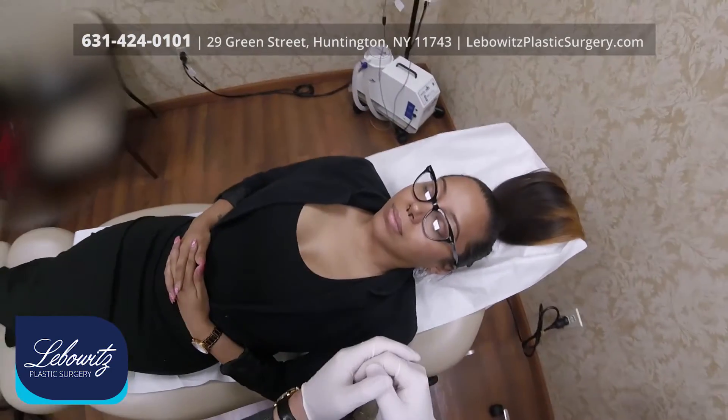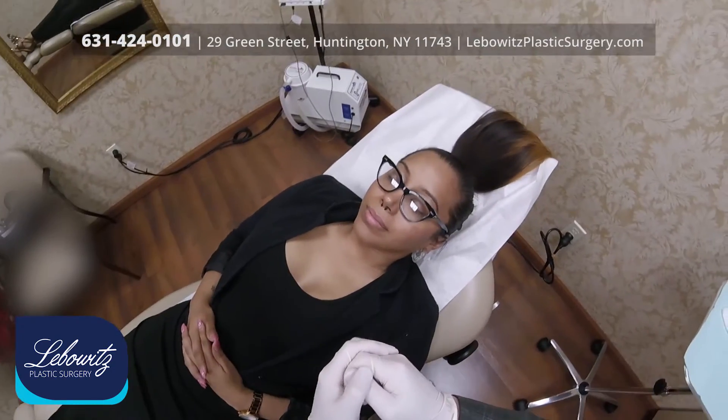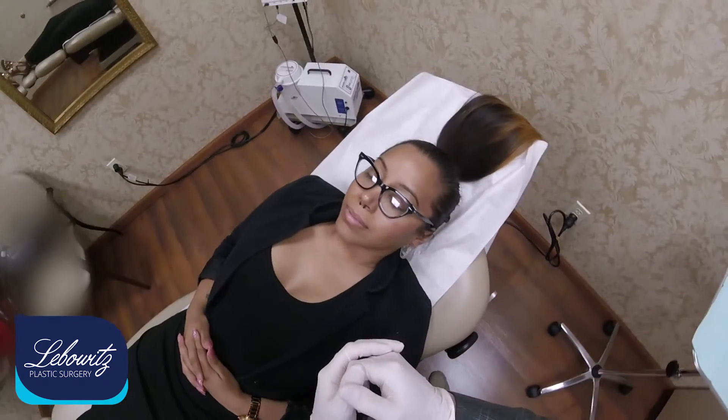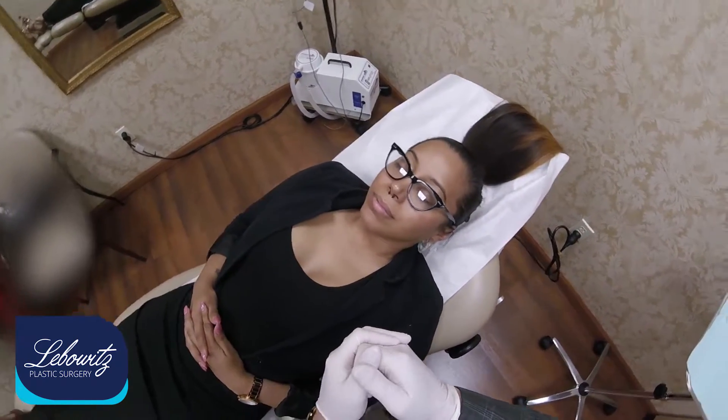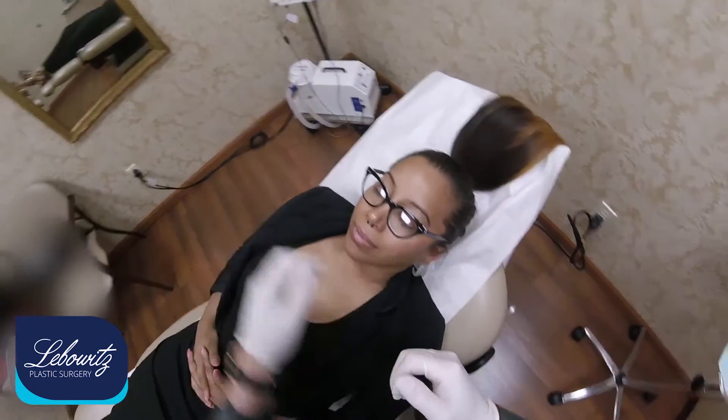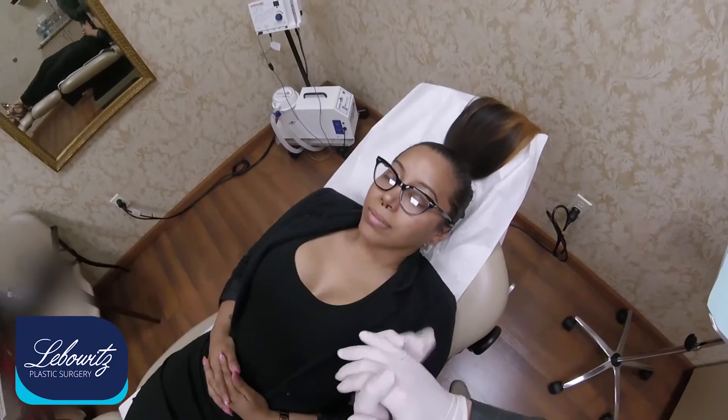Your lip injection expert who does very natural lips without bruising, without pain, and the results are extraordinary. Today we're doing lip augmentation on this young lady. We're going to use the blunt cannula technique.